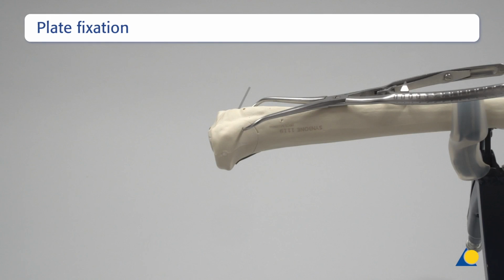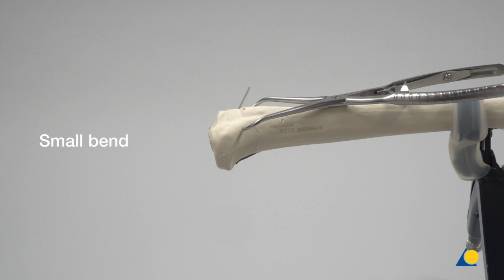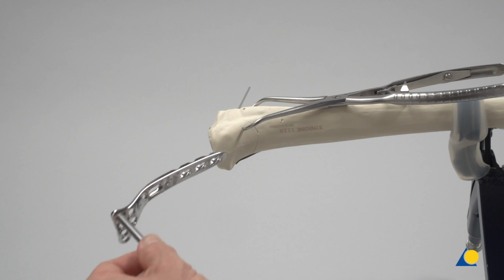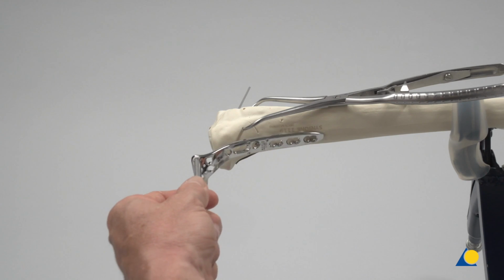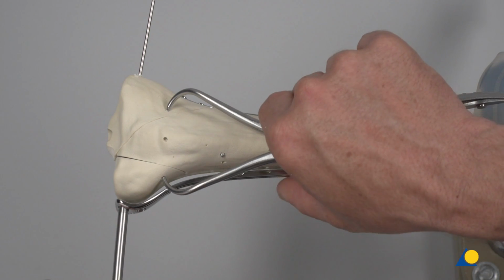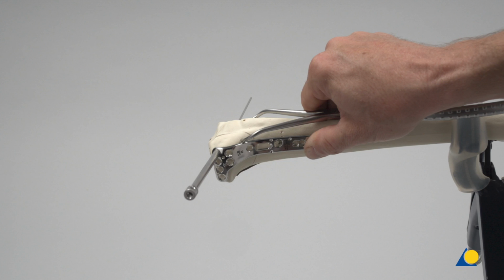The appropriate sized plate is selected to buttress the lateral condyle. In this exercise, a small bend 3.5 VA LCP proximal tibial plate is used. To facilitate plate positioning, the locking drill sleeve 2.8 mm diameter is attached to the uppermost proximal hole of the plate and functions as a handle to position the plate on the tibia. The plate is provisionally fixed with a K-wire at the proximal end.